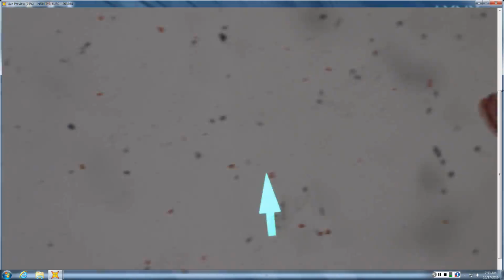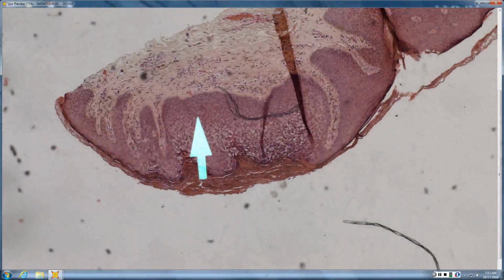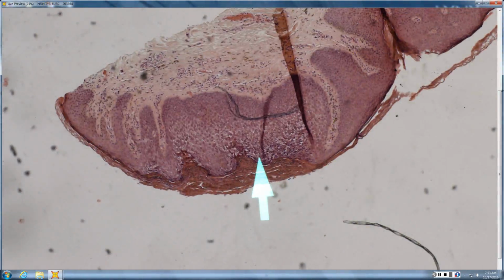So it looks like you have a little epidermolytic acanthoma. That's exactly what it is. So EHK, epidermolytic hyperkeratosis in a little cup-shaped acanthoma, often with crateriform architecture. This one's maybe less crateriform and just acanthotic.